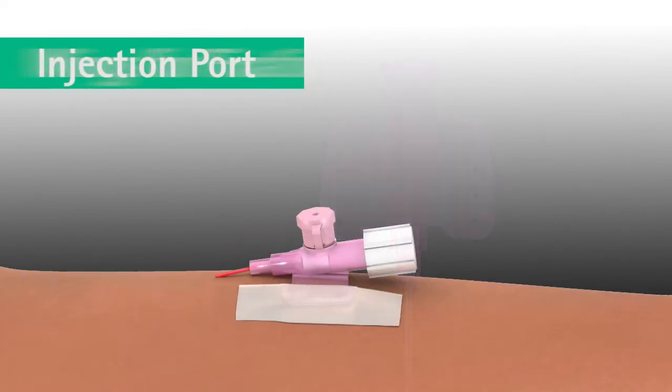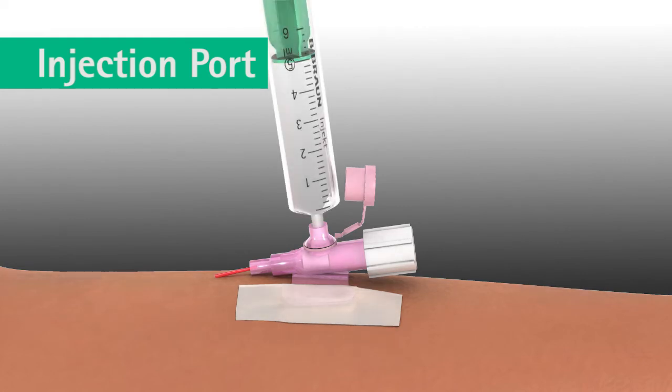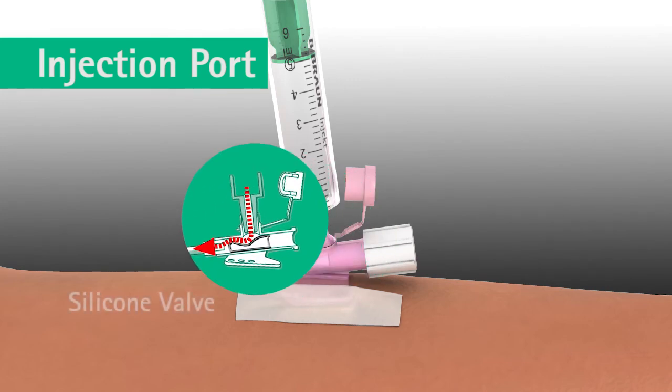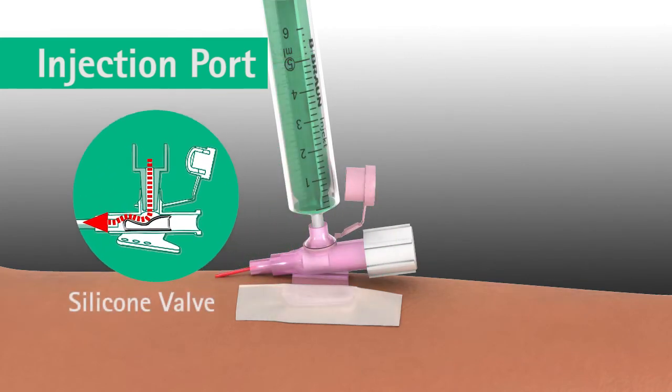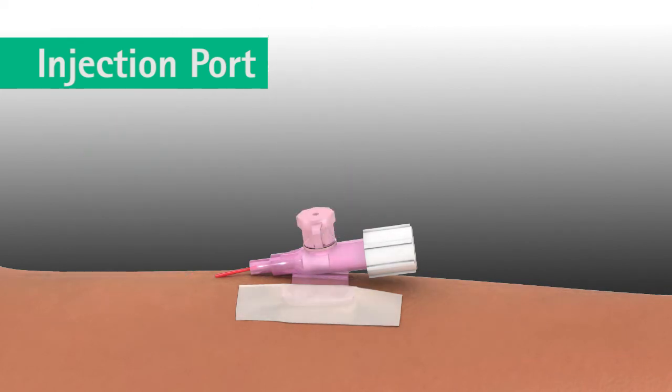The integrated injection port on the catheter hub of the Varsafix safety IV catheter offers hygienic needle-free injection of medication, eliminating any risk of a needle stick injury. To inject medication, attach a syringe with a slight twisting movement. The integrated injection port contains a valve which opens and closes automatically and prevents backflow of liquids. It is possible to lock the injection port by turning the protective cap 180 degrees.